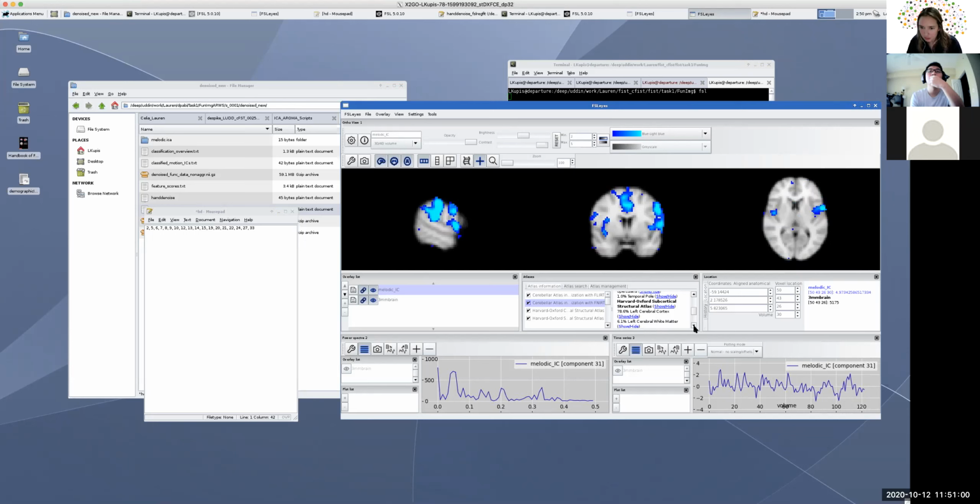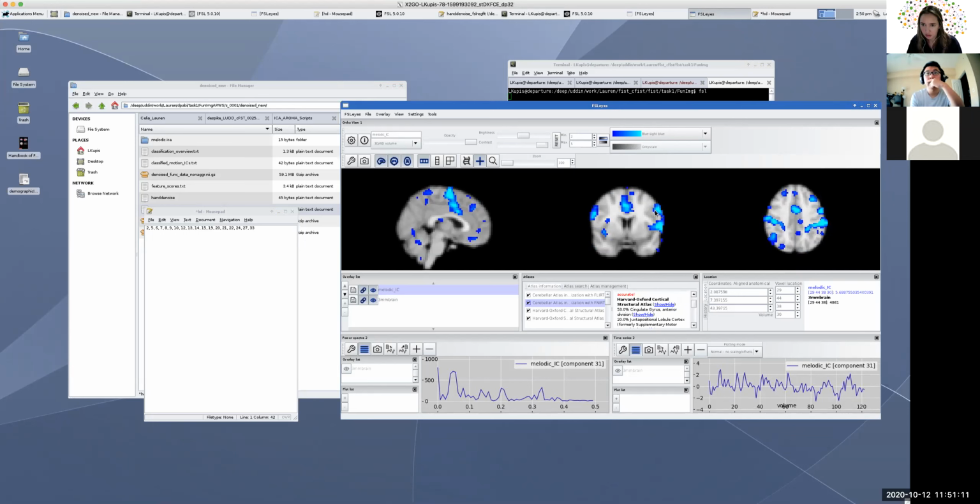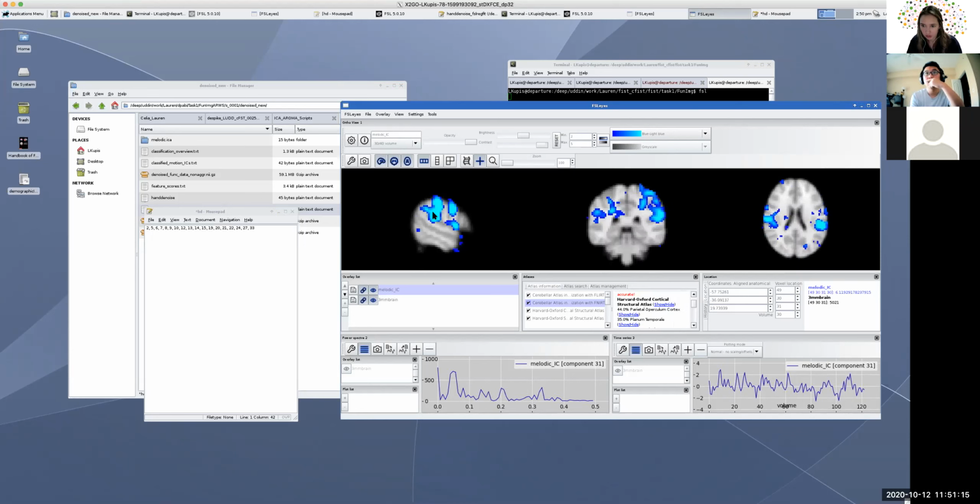Okay, this looks pretty fine. Okay, so this one's another one that's pretty good, and it is a little bit mixed, but there's still the high power.